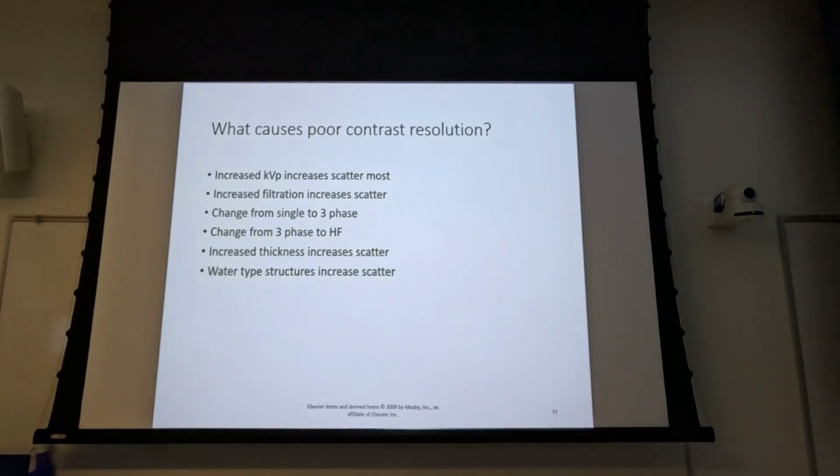We could. Would we see a difference? I don't know. We have a tendency to get locked into a specific mindset that kVp has to be this, and kVp affects our contrast. And you go talk to some of the older techs especially, and that's what they're going to say. What do you use to control contrast? They're probably going to say kVp.